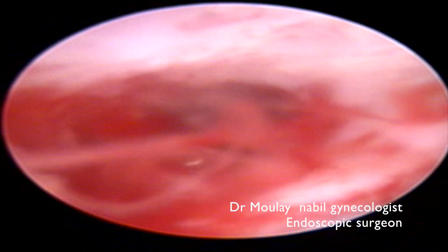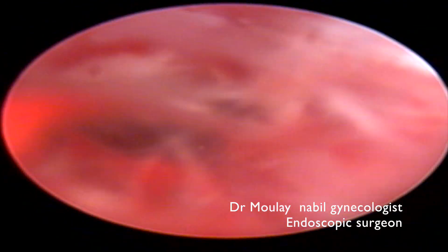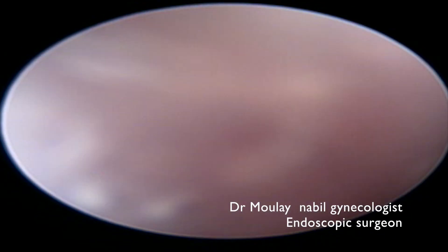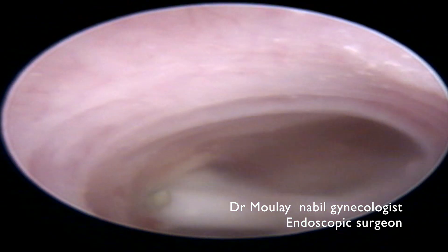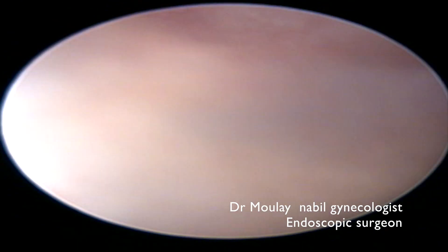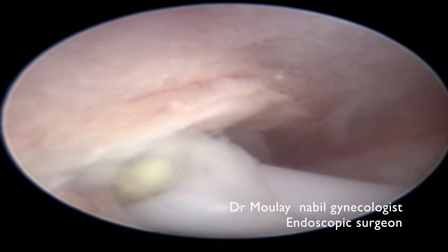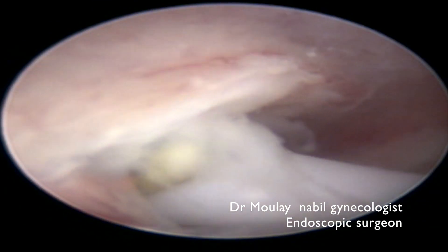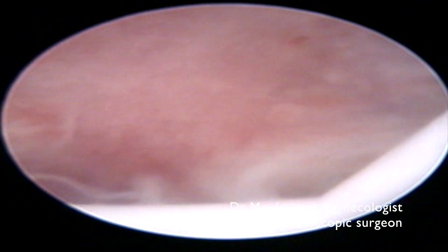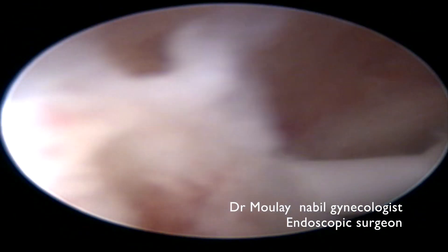We perform hysteroscopy by vaginal approach without using a speculum. You can see the traumatized area of the cervix, and you can see the IUD inside the cavity in complete right rotation, with a left myometrial perforation and a right myometrial perforation.